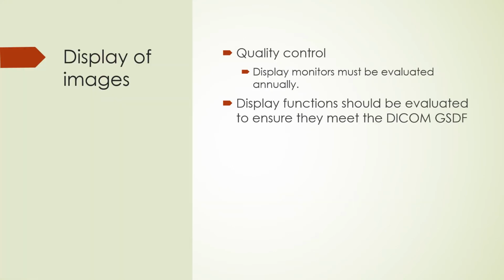It is important for computer monitors to display medical images correctly. Workstation display monitors are evaluated annually to ensure that they all have adequate maximal calibrated luminances and the same display characteristics. Display functions of grayscale monitors and color monitors that display grayscale images are also evaluated to ensure they meet the DICOM GSDF standards, which we shall talk about shortly.